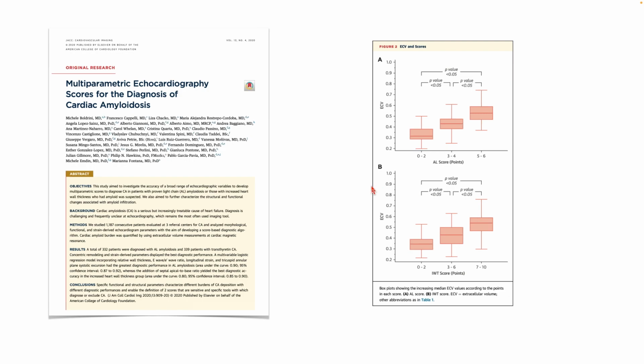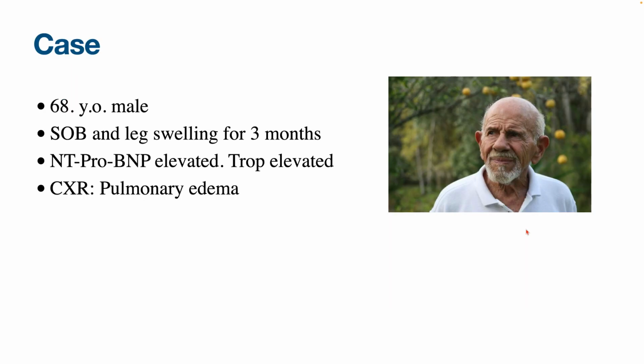What is still interesting to know is whether, with treatment, these scores will regress and whether that could predict the decrease in the volume of amyloid. So that will be a nice next step in terms of research for this.